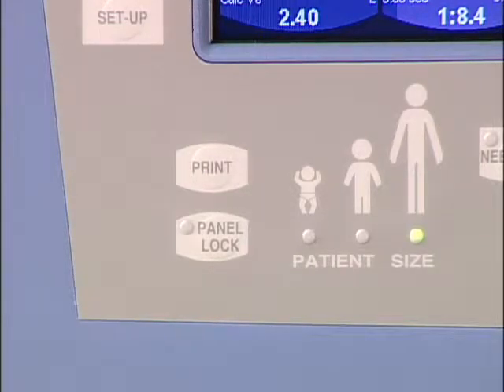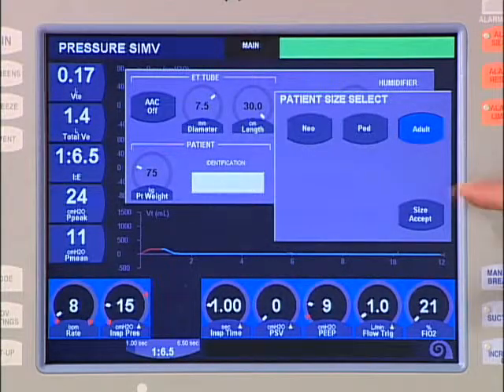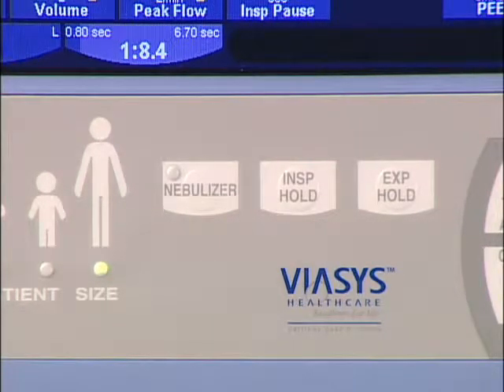The patient size indicators are for display purposes only and not changeable from the front panel. Patient size must be changed from the setup screen. The nebulizer button activates the integrated nebulizer for 20 minutes, and the delivery of nebulized medication is synchronized with the inspiratory phase of the breath. To deactivate the nebulizer before the 20-minute duration, simply touch the button a second time. Note that in order to power the nebulizer, a flow of at least 15 liters per minute is required, and the nebulizer is not active while AVEA is operating on its internal compressor. Refer to the operator's manual regarding operation of the nebulizer with Heliox gas delivery.